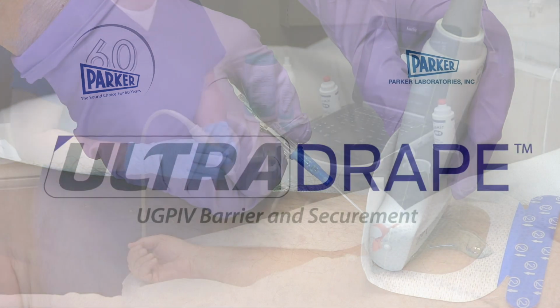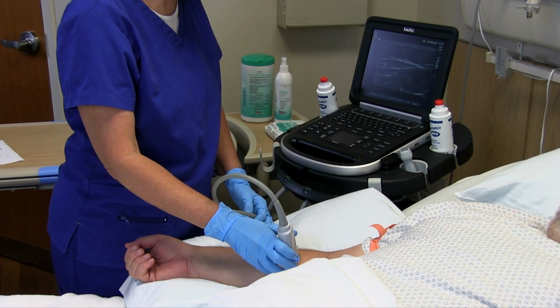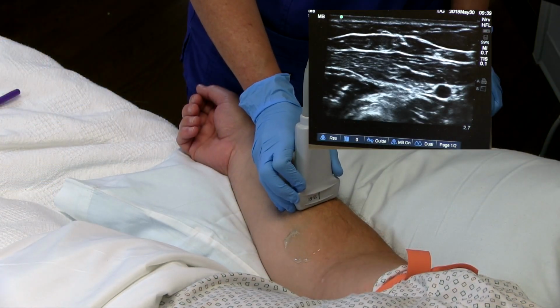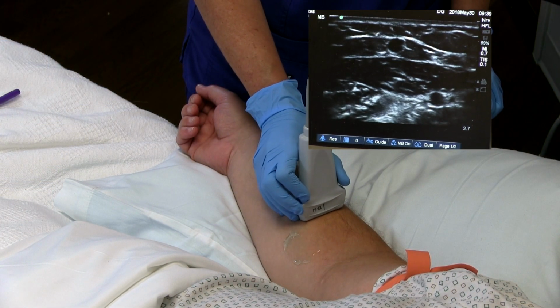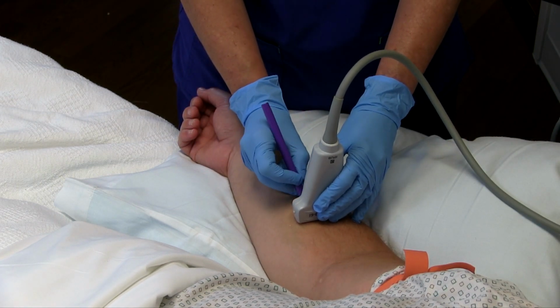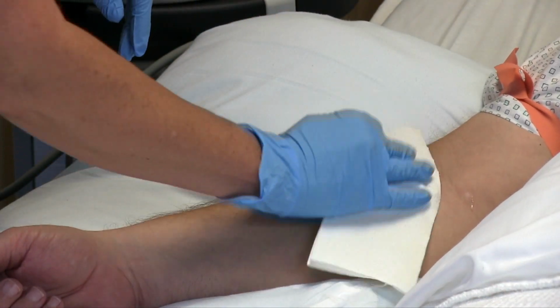Instructions for use. Begin the procedure with an ultrasound assessment, selecting a vein which best meets size and depth requirements. A catheter should not take up more than 45% of the vein. Mark the vein you intend to cannulate and prepare your catheter and supplies.